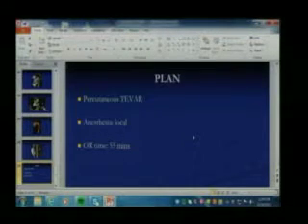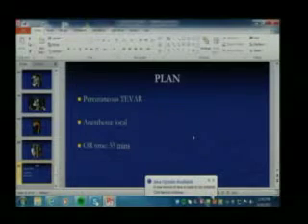Our plan is to scan her in a month. Her creatinine was elevated as well, so we just used IVUS to see where we're going to land it, and then we did a completion angio. We used a total of 15 ml of contrast in the case.